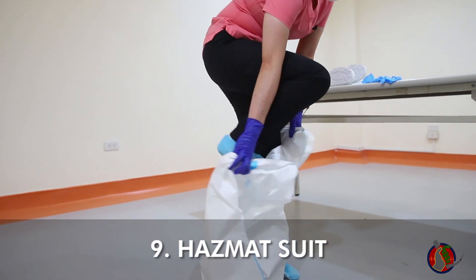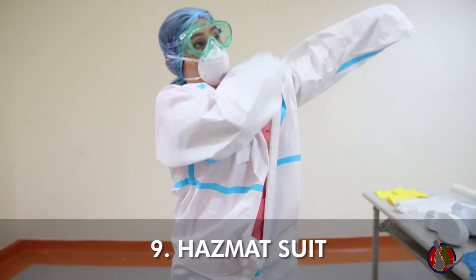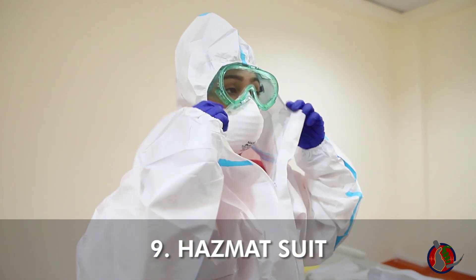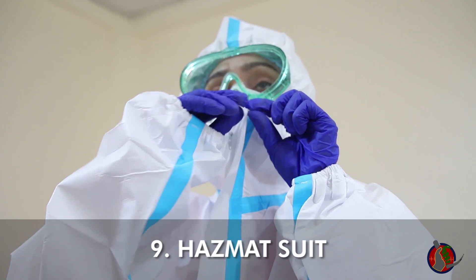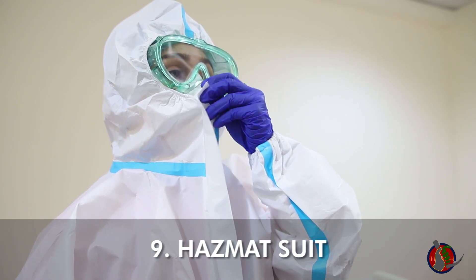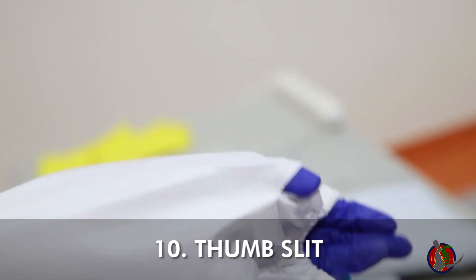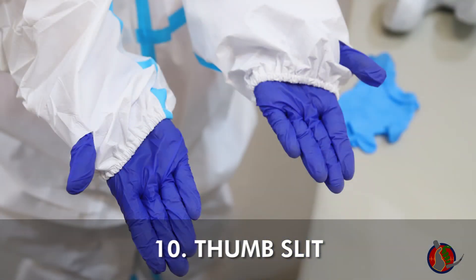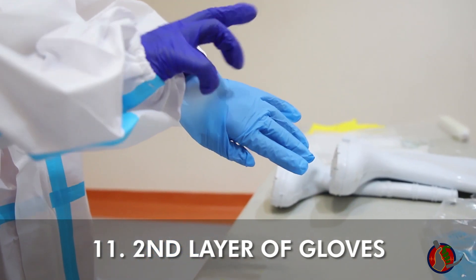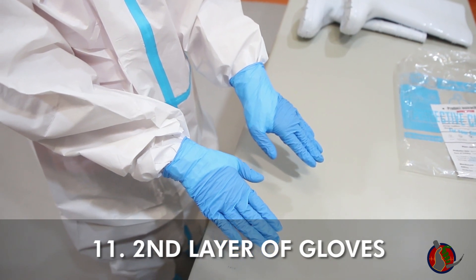Put on hazmat suit and zip up to include the hood. Cut a slit over the thumb area, then slip thumb out of the gown. Put on the second layer of gloves and pull gloves as far up into the forearm. Make sure all gaps are completely covered.